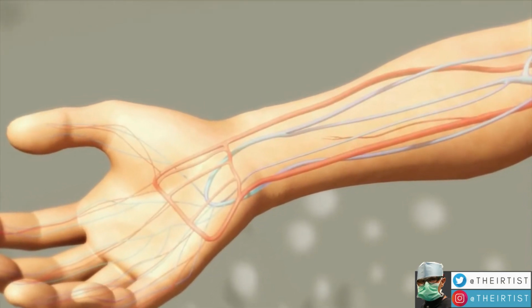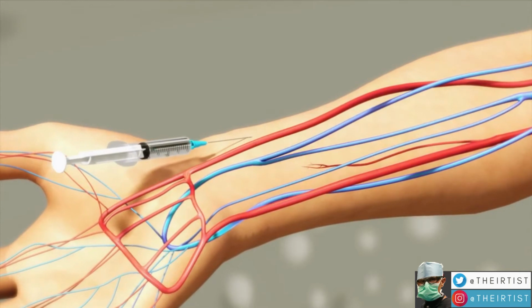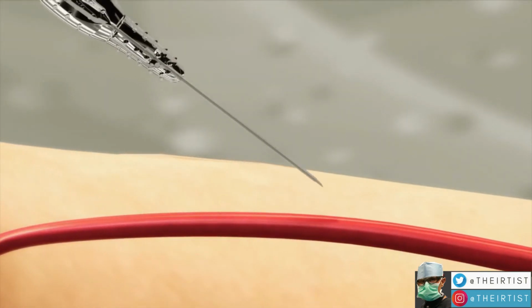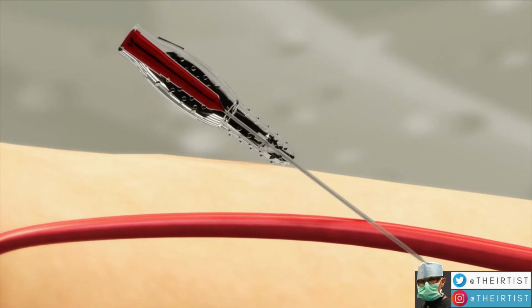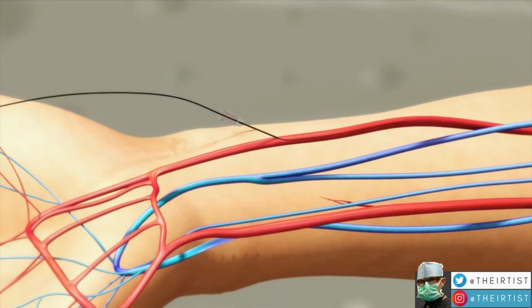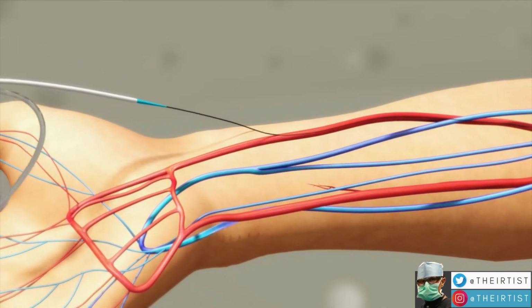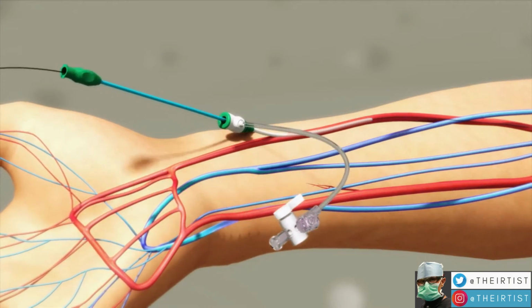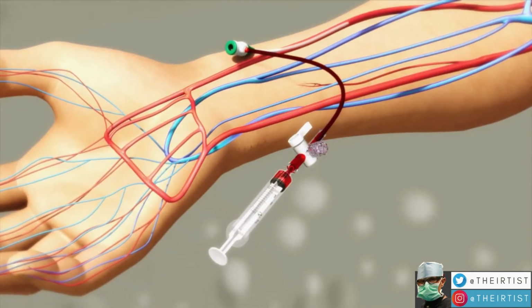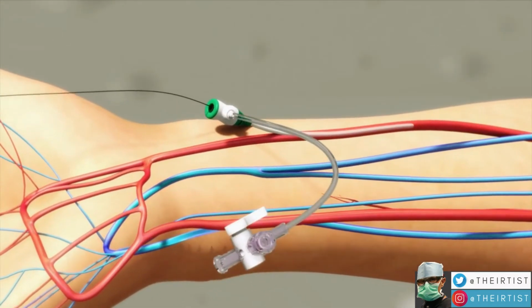Once the access is obtained in the radial artery through a tiny little needle under local anesthesia, it literally takes us about 30 seconds to be within the pelvic vasculature, and it does not really matter. It's not a long way. We have longer catheters that can reach. We literally circulate with the blood using really tiny instruments. And you can see here we are introducing what we call a vascular sheath that will allow us to perform a safe access and intervene on the patient's prostate safely throughout the procedure.